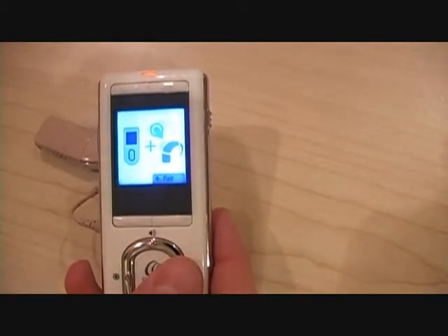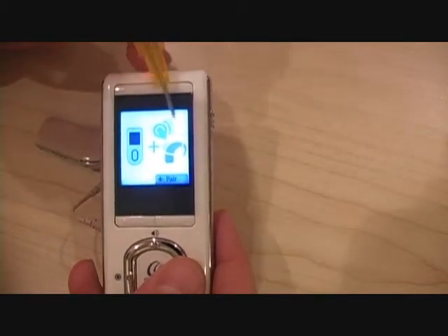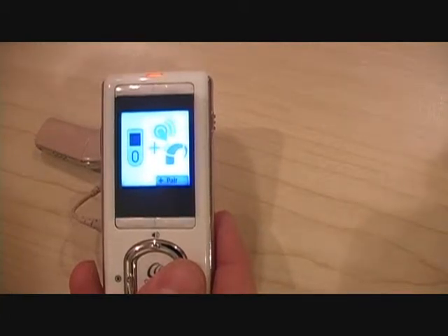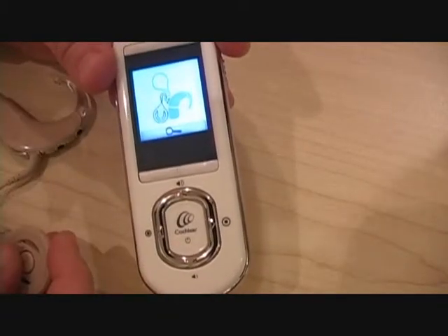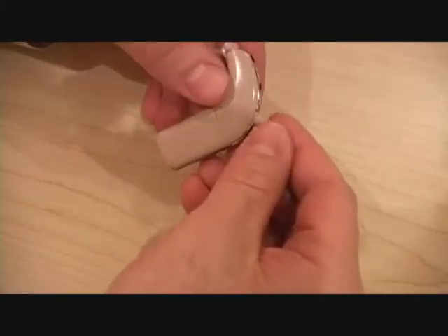If the remote shows a symbol of a processor with green communication lines coming from the coil, then you know that your cable is good. If your remote continues to show that a coil is removed from the head, then your cable is bad. Replace the cable by pulling the cable directly out of the processor and the coil.